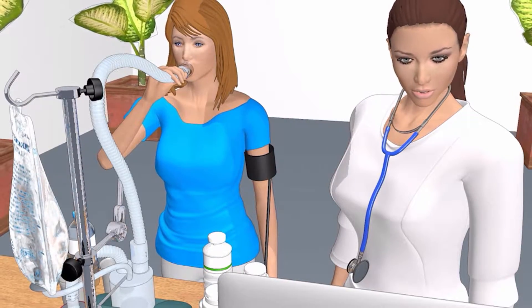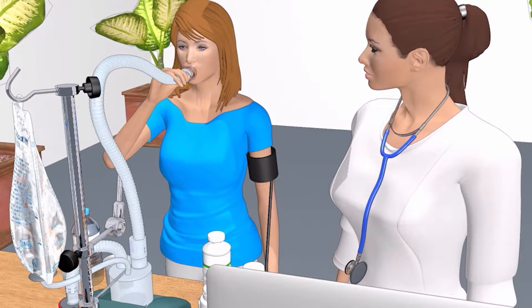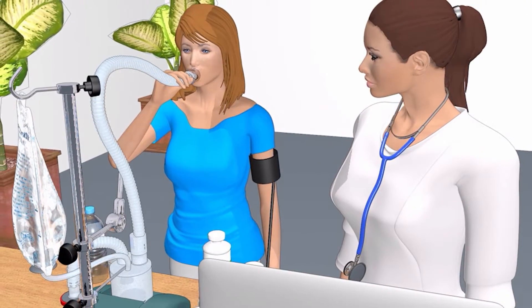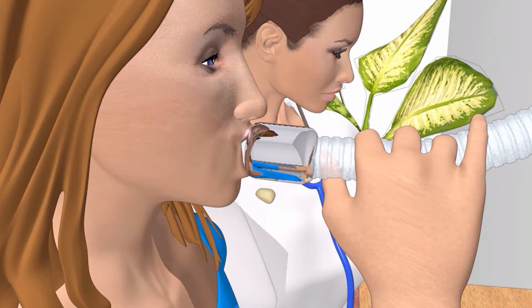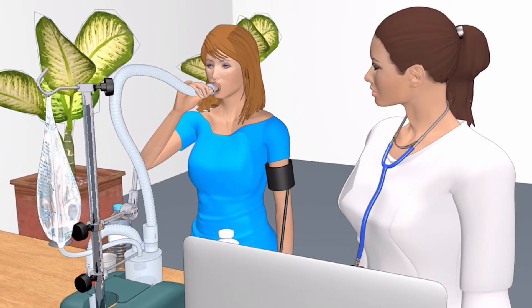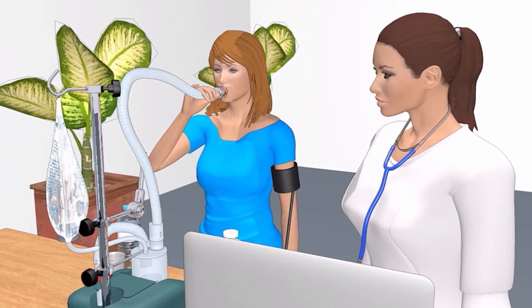You will start by inhaling a 3% saline mist to help loosen the mucus in your lungs. You will place the breathing tube in your mouth and breathe normally for 5 minutes. During the breathing, we will measure the amount of oxygen in your blood.